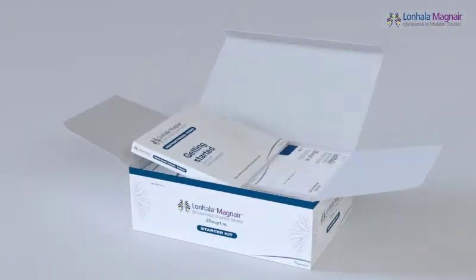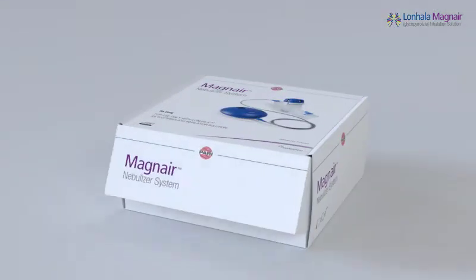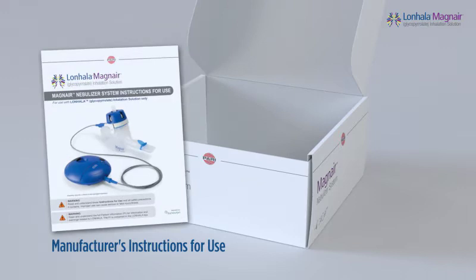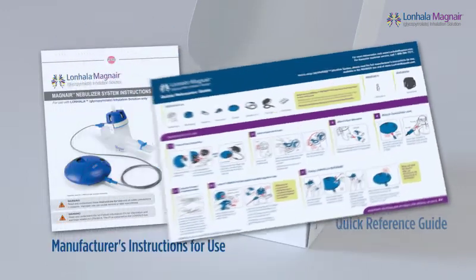Your starter kit contains this instructional video, the Magnair nebulizer system, and a 60-dose supply of Lanhala. Before using your Magnair nebulizer system, please also read and understand the manufacturer's instructions for use included in the Magnair box. There is also a Lanhala Magnair quick reference guide included in the Magnair box.